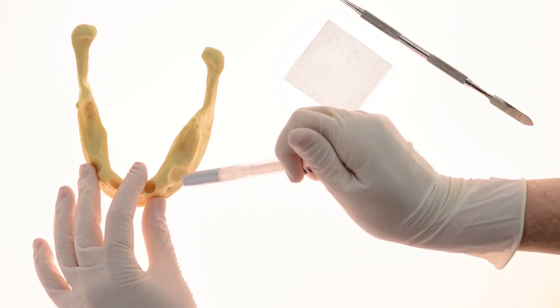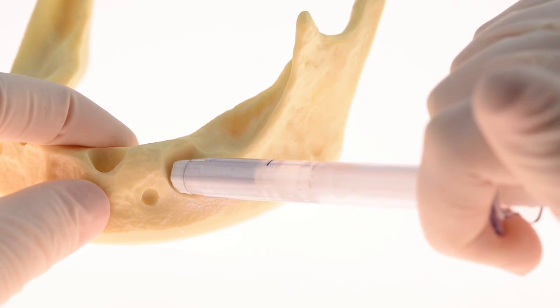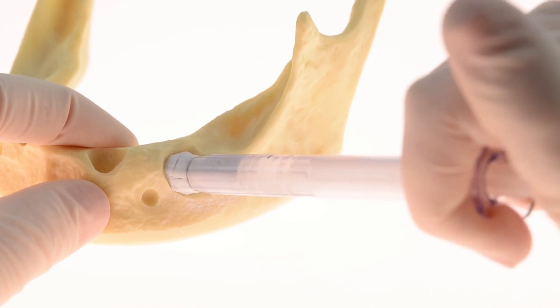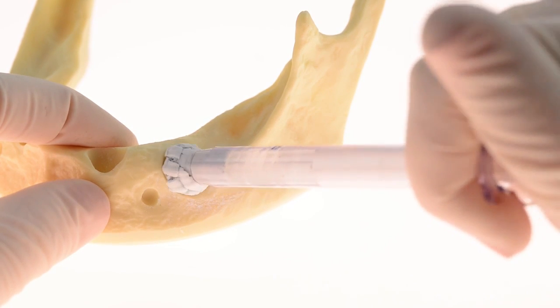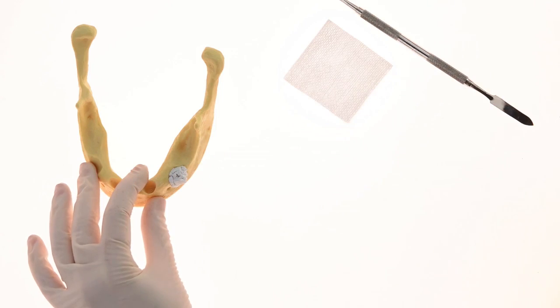Approach the defect on a 45-degree angle and begin ejecting the material into the site. During this step, use the driver head to stabilize the material in place using light condensing movements. Continue this process until the defect is slightly overfilled.